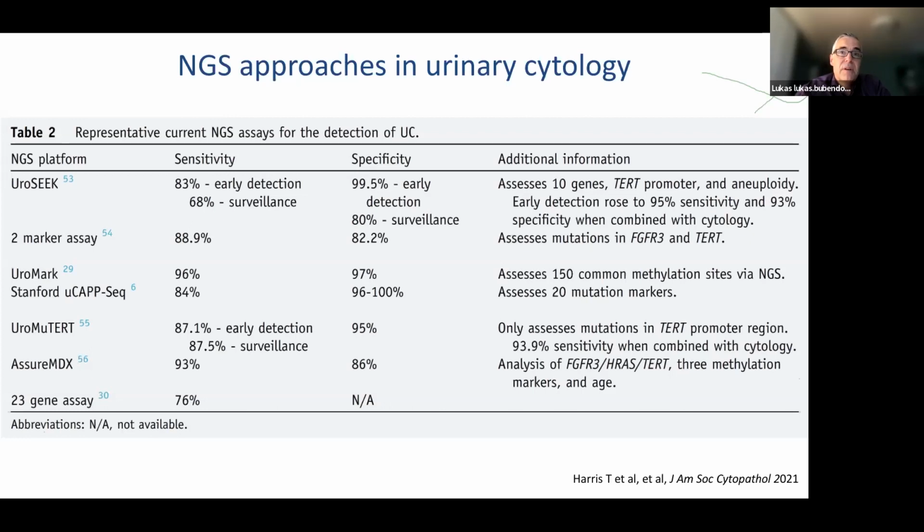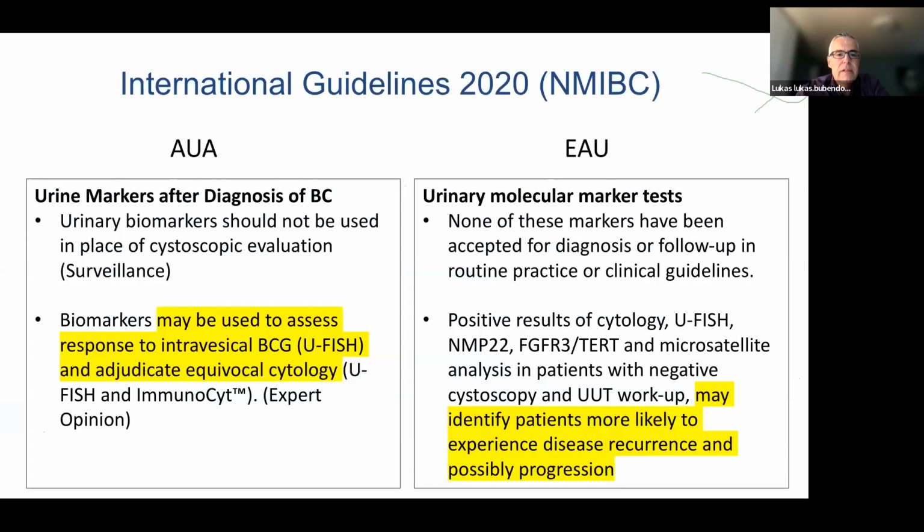But many of these studies are problematic in the way I just explained. The endpoint is fuzzy. It's not clear whether they really help to detect the high grade or whether they're just a marker for low grade and so on. So more work is to be done, but it's very promising because theoretically those mutations should be specific for neoplasia. Well, they will have an increasing role in the future.